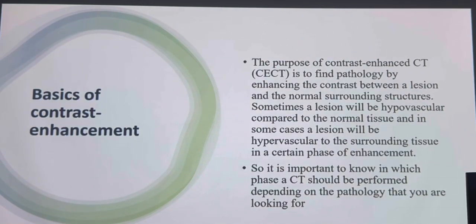So it is important to know in which phase the CT scan should be performed, depending on the radiologist's and technician's knowledge about how to do the examination, and from my aspect, the clinical information about the pathology.